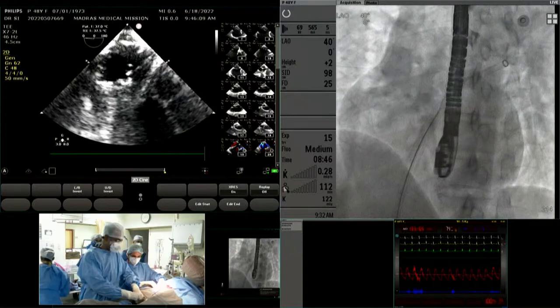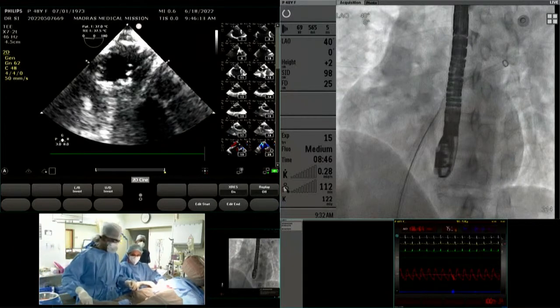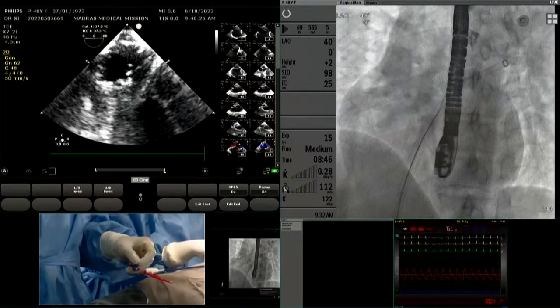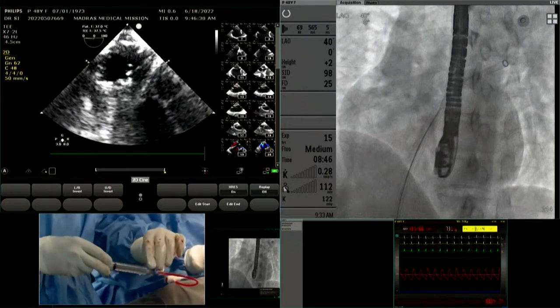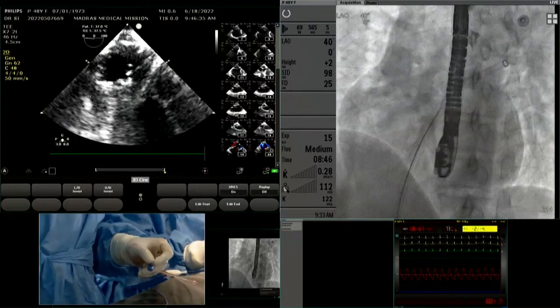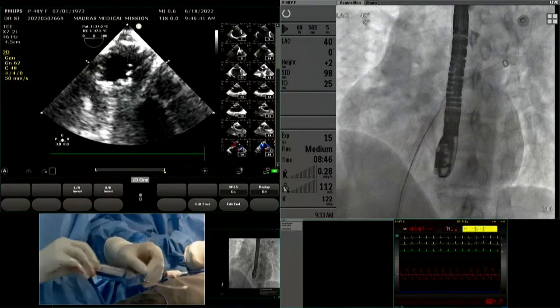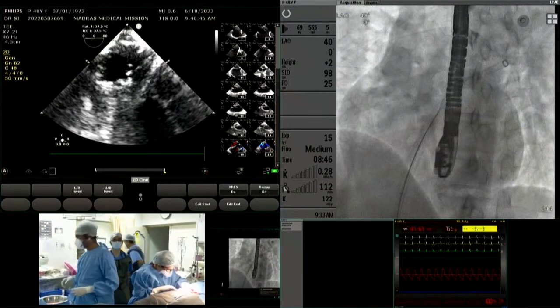If the patient is having a high RA pressure when I am advancing the catheter into the right heart, if the right atrial pressure is high, automatically left atrial pressure is high. And if the left atrial pressure is high, there is a strong indication that the left ventricular end diastolic pressure may be high. So if the RA pressure is very low, the LA pressure is low and the LVEDP is also likely to be low. So this is the logic behind the initial presumption about whether the patient is likely to have a restrictive LV physiology or not. It's very surprising to see a patient who is having an RA pressure of 1, 2 and 3 having a restrictive LV physiology.